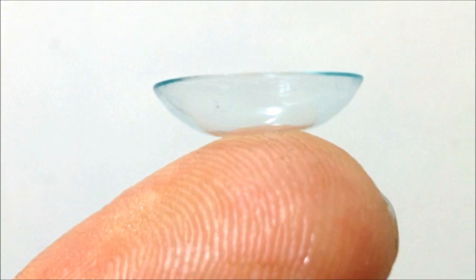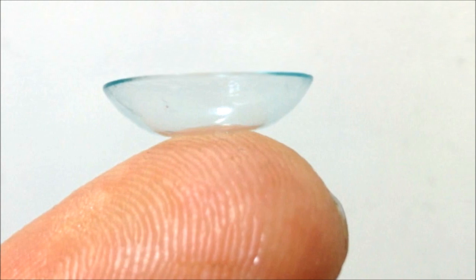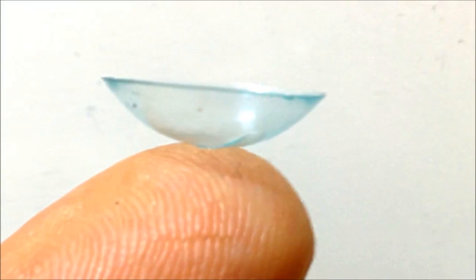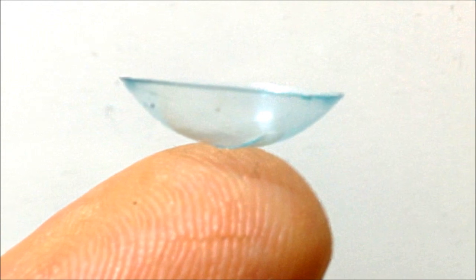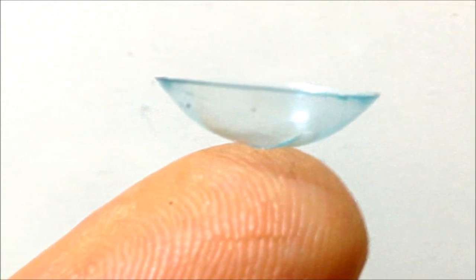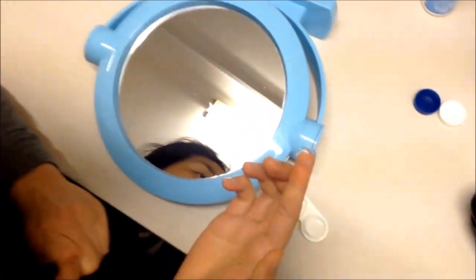When the contact lens is positioned correctly on the finger, it takes on a characteristic bowl or cup shape with well-defined edges. However, when the lens is inside out, it takes on a more shallow, saucer-like appearance with slightly outturned edges. Position an angled mirror in front of you.